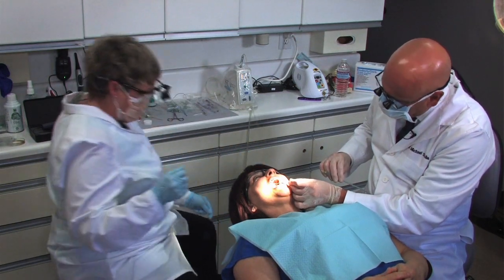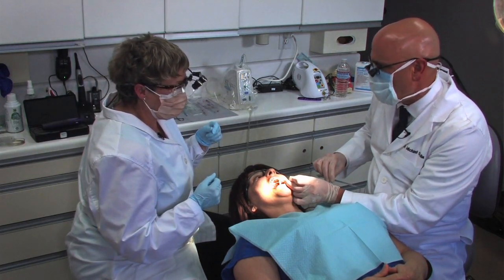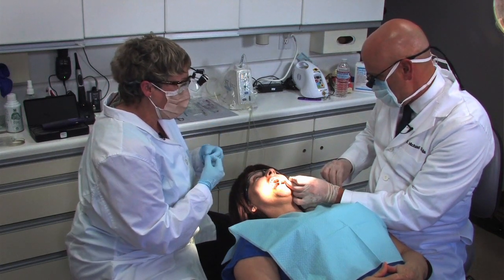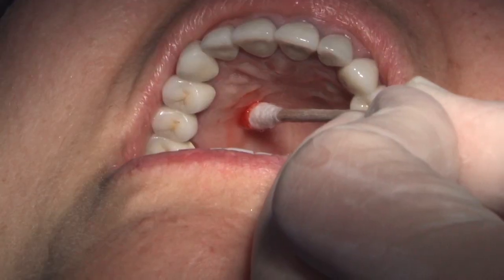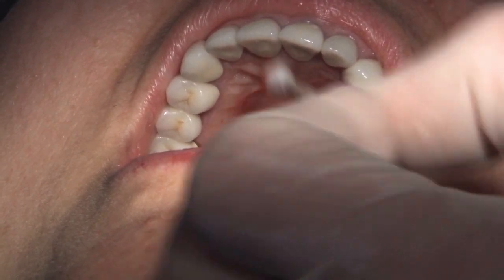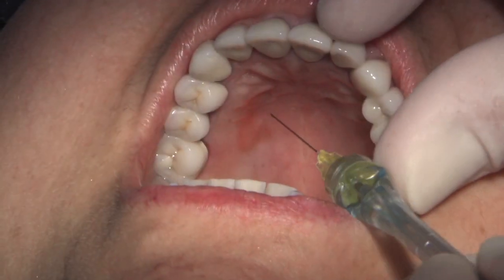I remember being taught in school for a palatal injection to use the mirror handle and then inject next to the mirror handle still in place. With this technique, we're trading off one right on top of the other. Not all clinicians are comfortable doing that, and also to avoid taking our sterile needle tip in contact with other objects — just go right to the middle there.